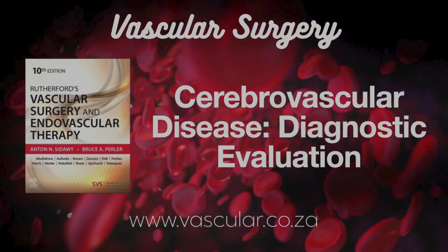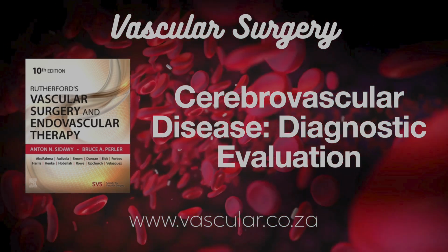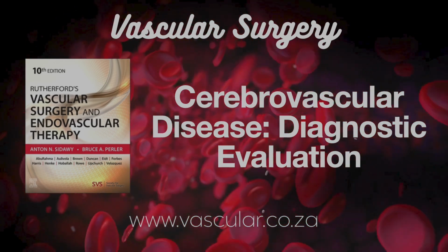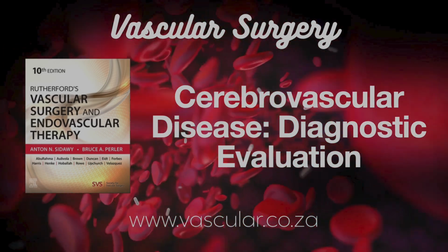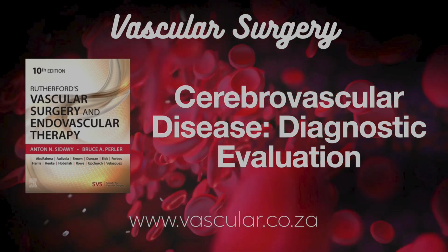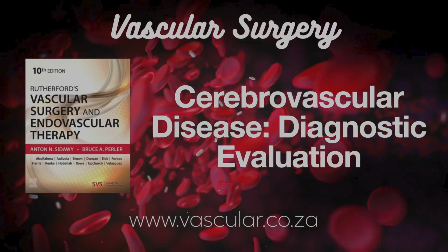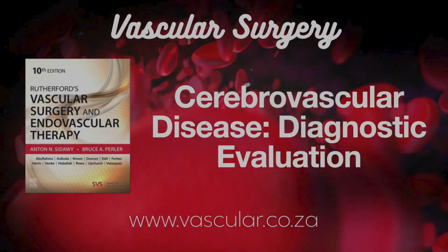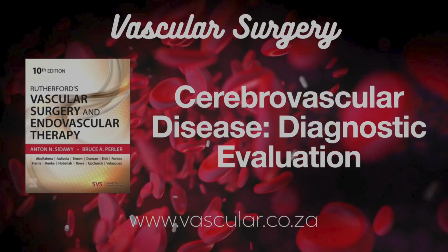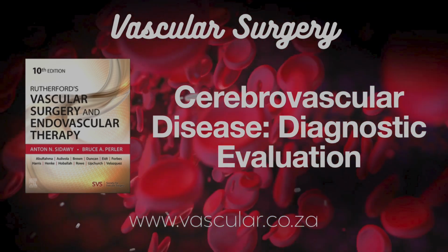What about screening people without symptoms? Should everyone get a carotid ultrasound? No, not generally. The SVS suggests considering DU screening for asymptomatic stenosis only in specific high-risk groups and only if they are actually candidates for and willing to consider intervention if something significant is found. Who falls into those high-risk groups? People with known peripheral vascular disease, PVD, or those over 65 who also have coronary artery disease or a history of smoking or high cholesterol.